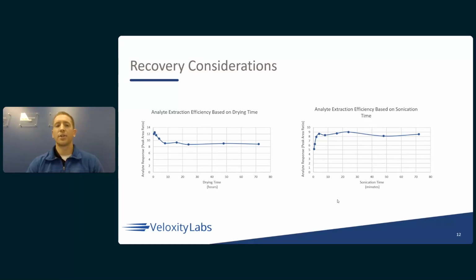So our traditional approach is just to let the samples dry overnight as we're doing initial method development on some other conditions. And then we'll test this as well over a longer period of time to make sure that as those samples dry, we don't see a loss in recovery. And the same thing for the sonication time. The figure on the right, you'll see as we reach about the 10-minute mark for sonication, it about plateaus. So for this method, I believe we used a 30-minute sonication time, but then it further doesn't significantly degrade afterwards. So finding that spot where you're going to have reproducible and reliable recovery based on these two attributes is very critical.